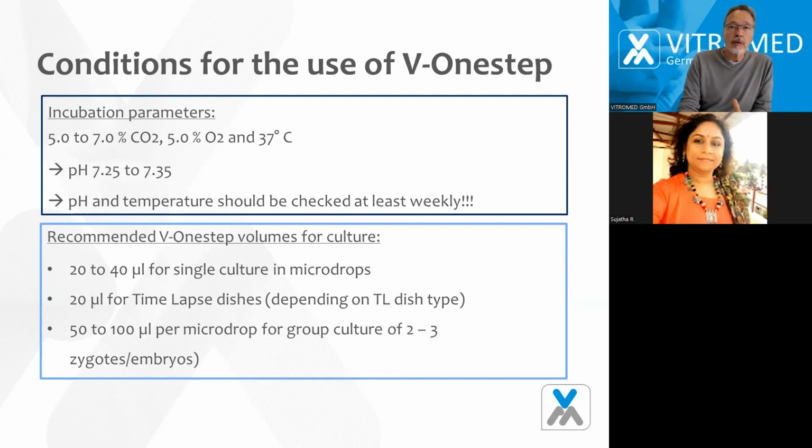For the culture, you can use every common dish and dish type tested for IVF. I would recommend for a single culture in microdrops, 20 to 40 microliters.